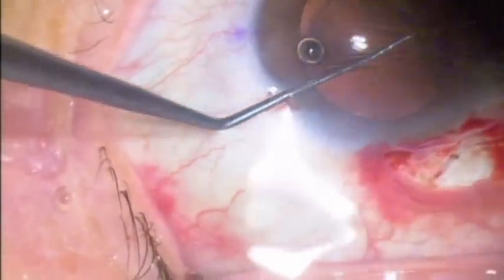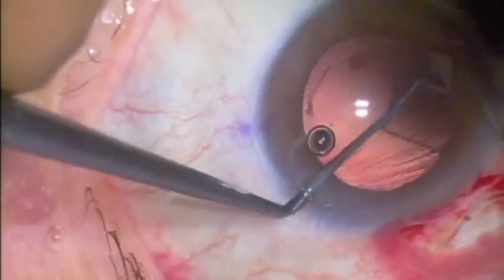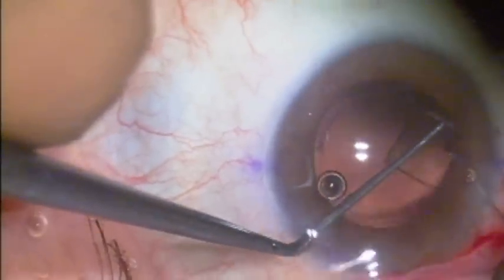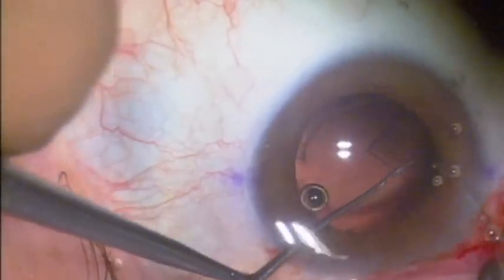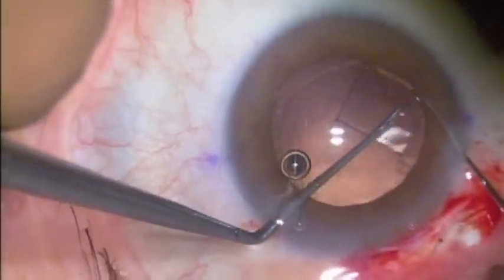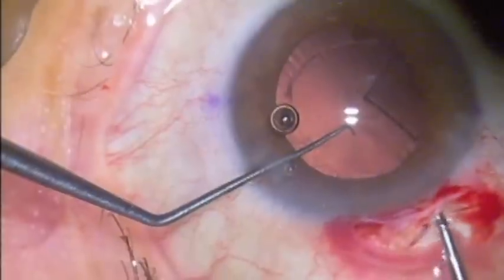Now I'm going to go after the haptic that is embedded in the nasal side. In this area, the capsule is fibrosed around the plate. The plate was digging into the posterior capsule posteriorly and elevated at the hinge. Here you can see that one of the whiskers is pretty socked in, and I'm carefully dissecting this out with blunt dissection. It's much easier to manipulate these plates and whiskers like this once you've cut them at the hinge.